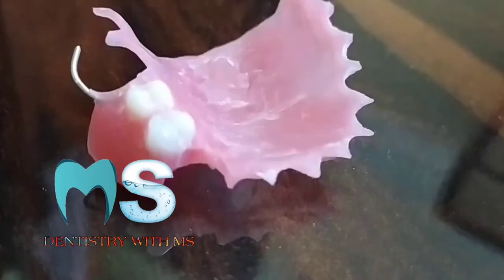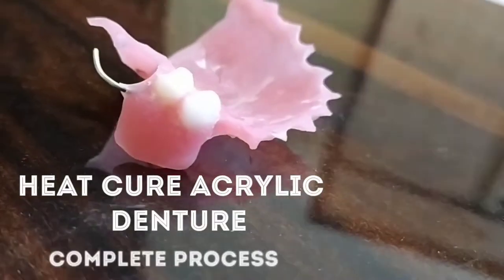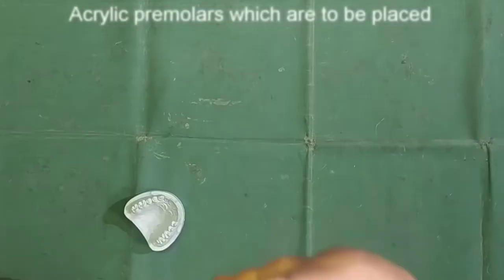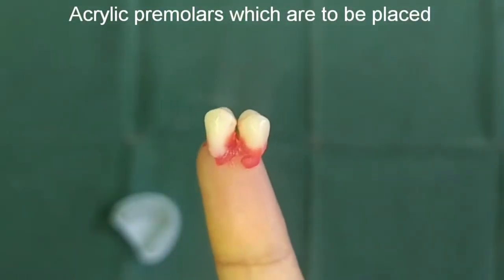Hey everyone, welcome to my YouTube channel. This time we are going to make the RPD from heat-cure acrylic resin material. We will study the complete procedure, and in this video we will place the acrylic tooth on the cast.